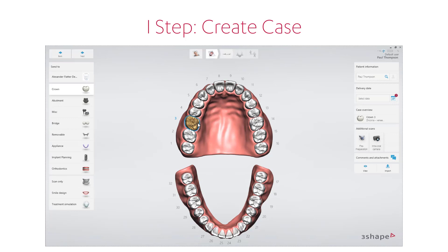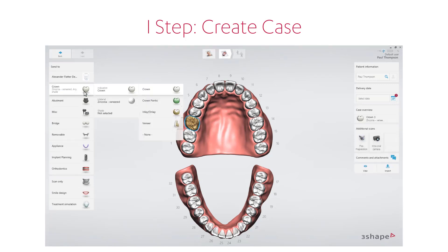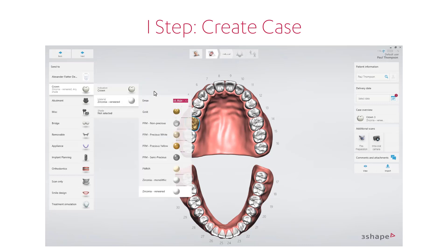Then it's time to select the type of treatment or the indication from the list on the screen. For example, a crown or bridge, implants or clear aligners, and other options too.